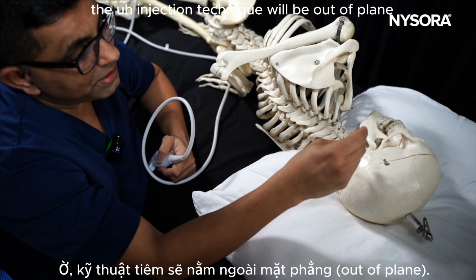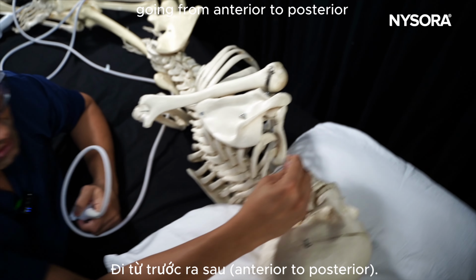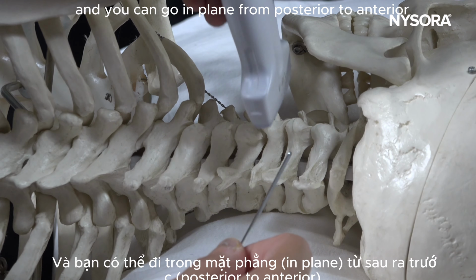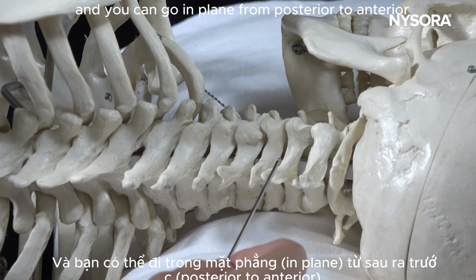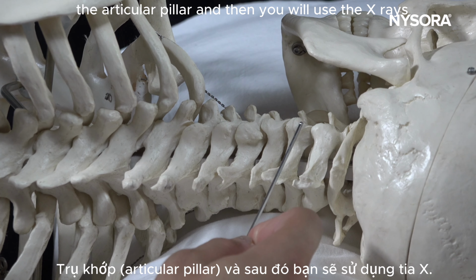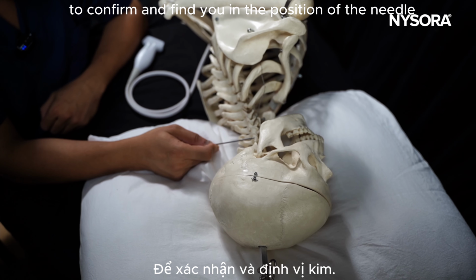The injection technique will be out-of-plane going from anterior to posterior, or you can do a transverse view and go in-plane from posterior to anterior, landing in the area we call the articular pillar. Then you will use X-rays, if you're performing radiofrequency treatment, to confirm and fine-tune the position of the needle. Thank you.